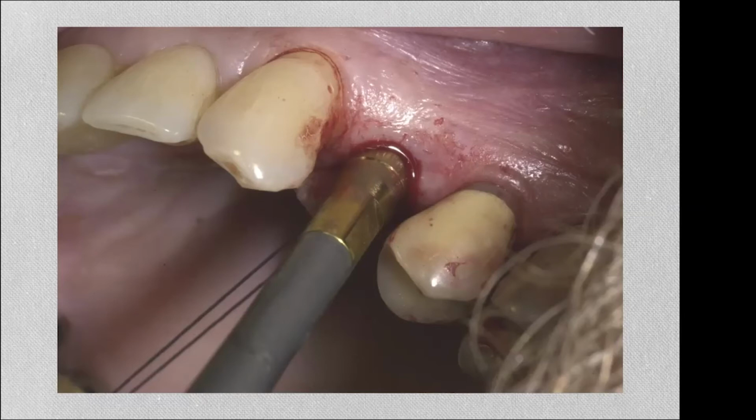And as I tap it to introduce it, it's going to bulge through the floor, but glancing off of the septum itself, and then I pull it toward the mesial, a sort of body movement of this instrument, push it this way, and give ourselves as straight a position as possible, okay? We're within about 10 degrees, which is as good as straight in my book, okay?